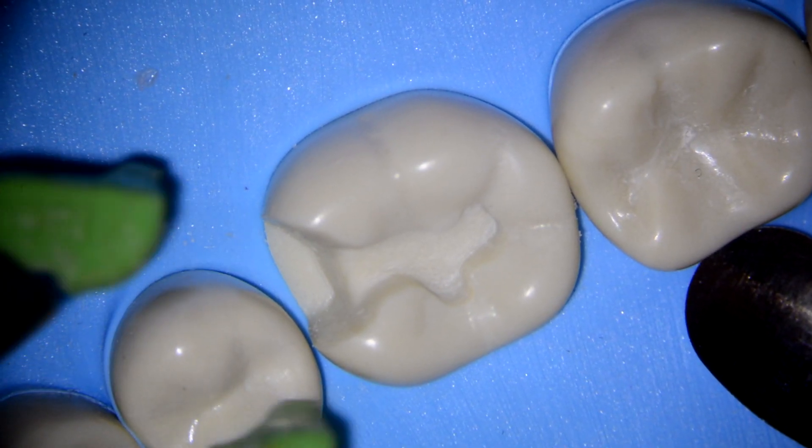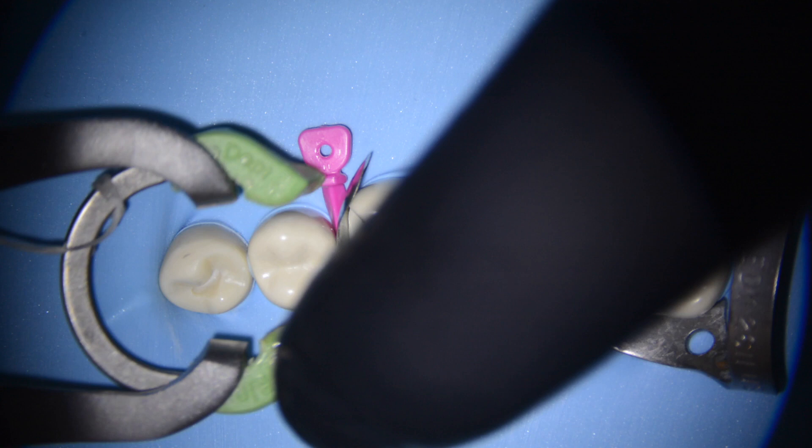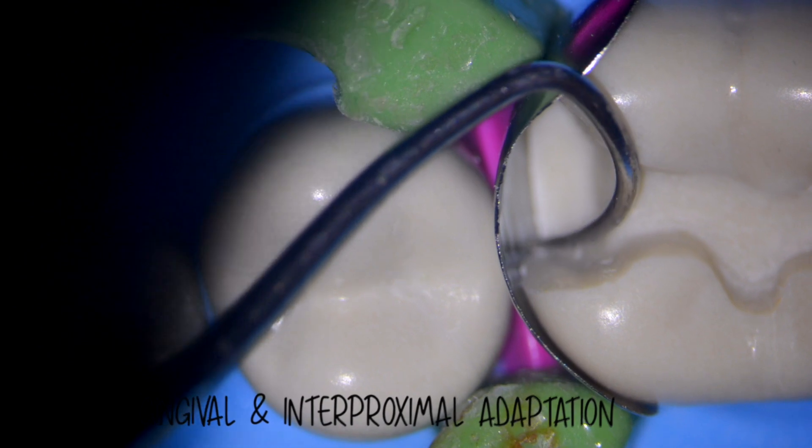Here I tried to mimic a cavity preparation that you might see in practice. The cavity extends well beyond the buccal proximal line angle, which makes it difficult to achieve proximal adaptation. The first step is to place the sectional matrix in with an anatomical wedge. As you can see, we have incredible adaptation along the gingival margin. This is important because if you don't have great adaptation, then you have to deal with cleaning the flash towards the end of the appointment.